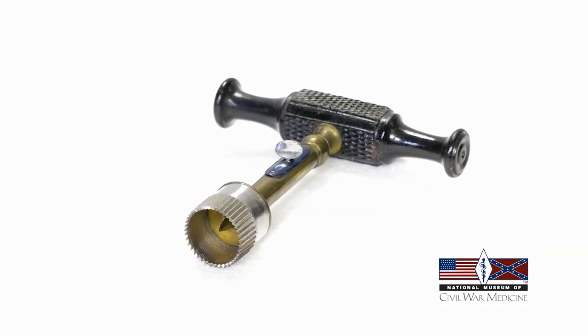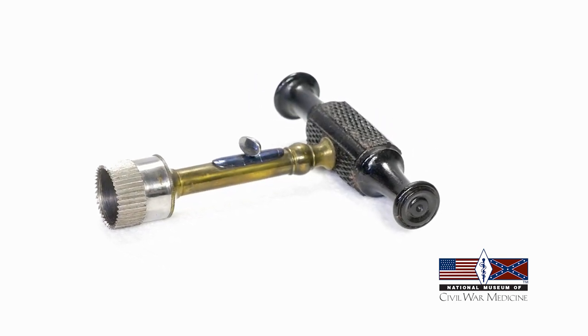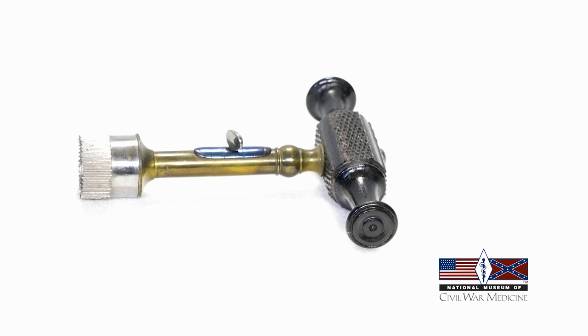This is a trephine, a cylindrical saw with a wooden handle. The handle could be unscrewed and used with blades of varying sizes.